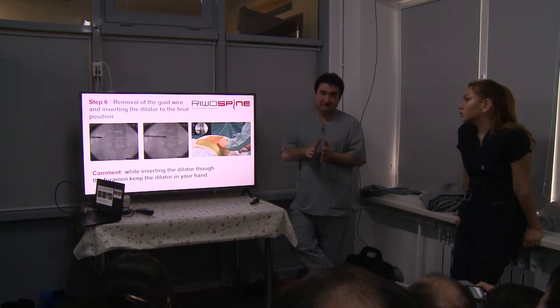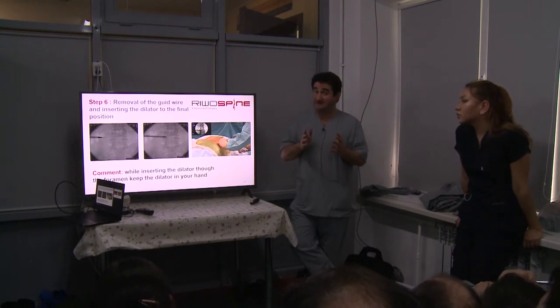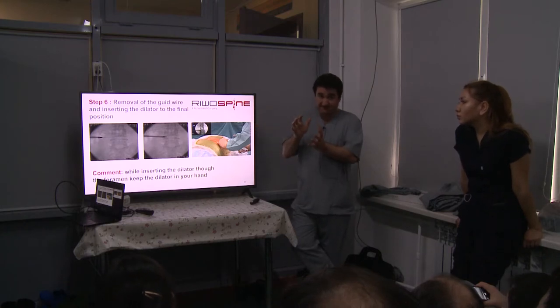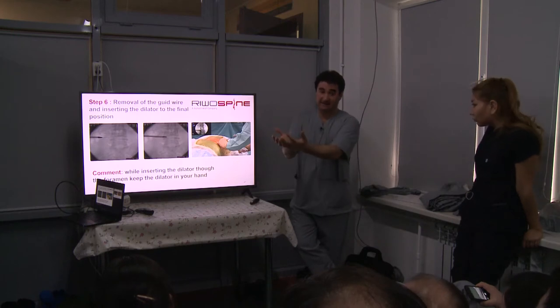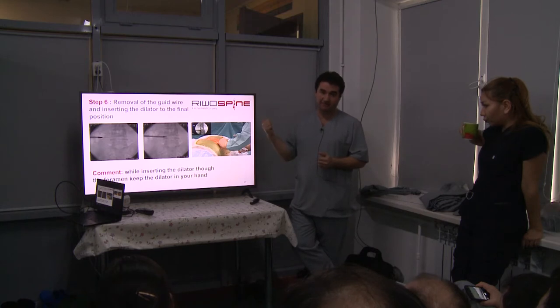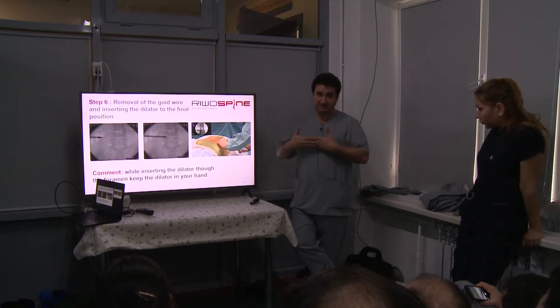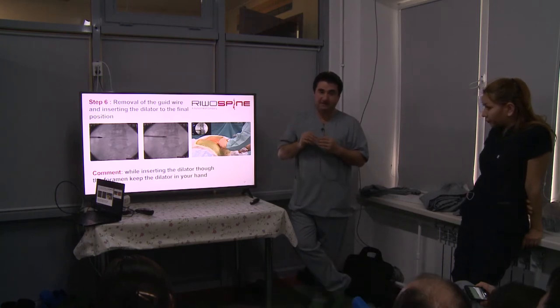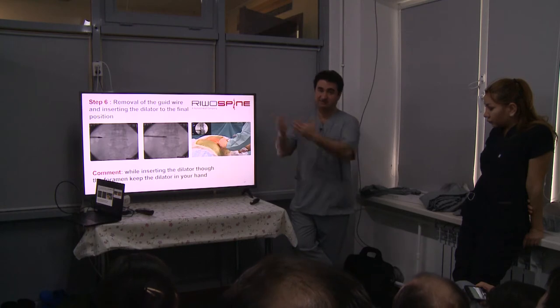Yeah. We mean disc collapse. Due to the disc collapse, if there is a stenotic foramen, then we don't prefer to do it again transforaminal. As we discuss, as there is a foraminal stenosis, and if you want to continue with the transforaminal, you have to do extra foraminal approach first. You have to stay at the outside and resect the facet joint and go inside. But we do this just to get access to the spinal canal, not to treat the stenosis.